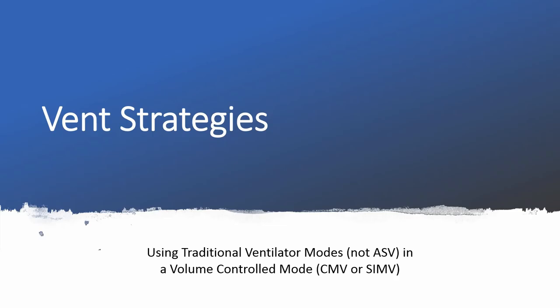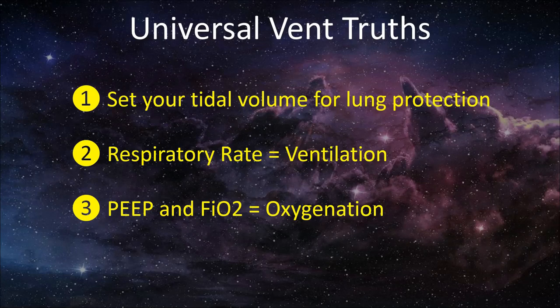So, ventilator strategies. First, I want to cover some vent strategies using traditional modes, not ASV. And we're just going to focus on volume control modes. We'll talk about ASV a little bit later.